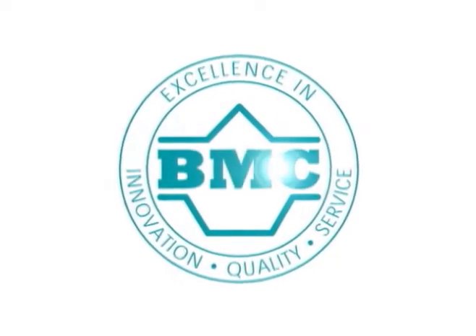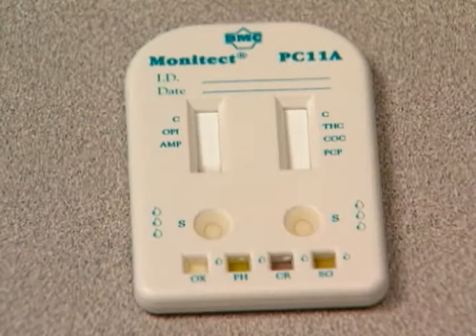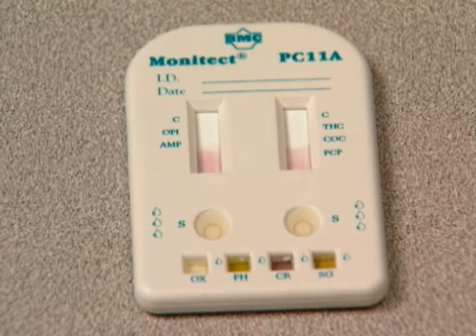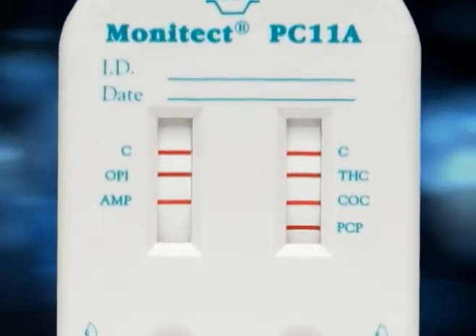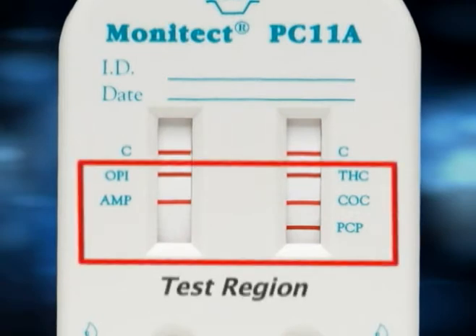Brandon Medical Corporation's Monitect drug screen cassette is a one-step lateral flow chromatographic immunoassay test for the rapid qualitative detection of various drugs of abuse and their metabolites in human urine. The Monitect cassette device contains membrane strips onto which drug conjugates are pre-coated at specific regions known as test regions.